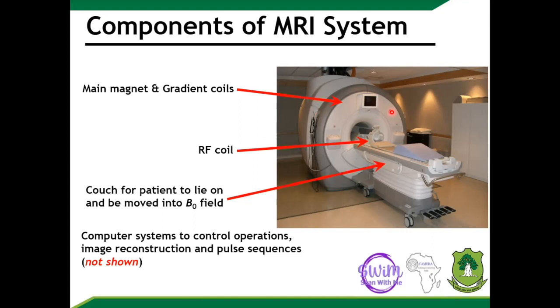Then, for example, if you are doing brain imaging, we use the head coil. Or if it is cardiac, there are different radiofrequency coils for different anatomies. I'm just using this as an example. And whatever we use to control that, I don't have to say it. We are all MRI technologists. You know it more. All right.